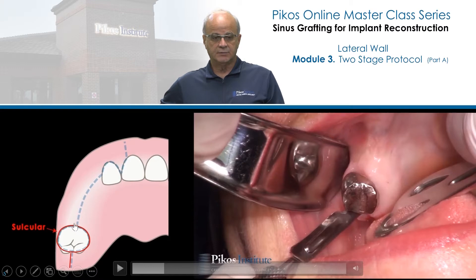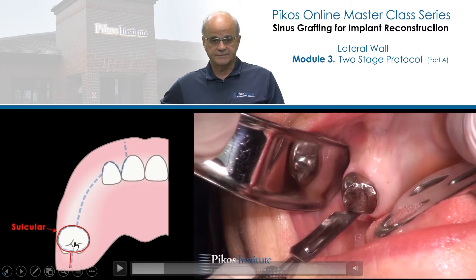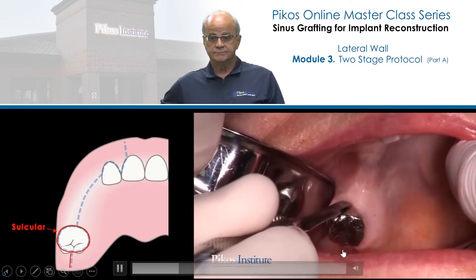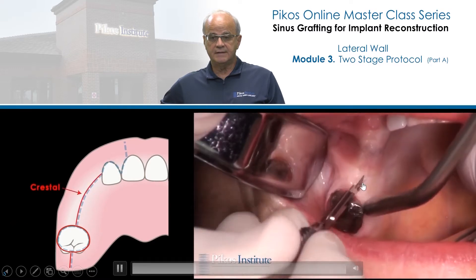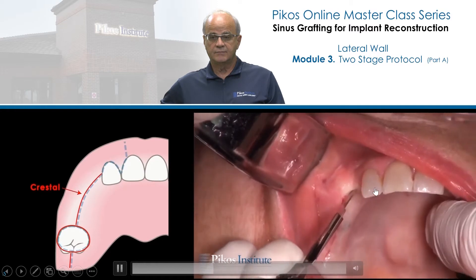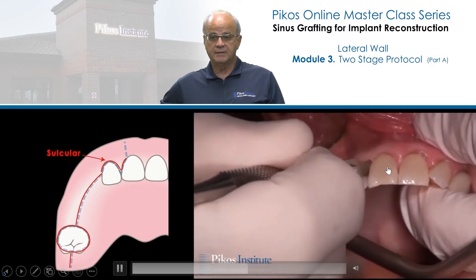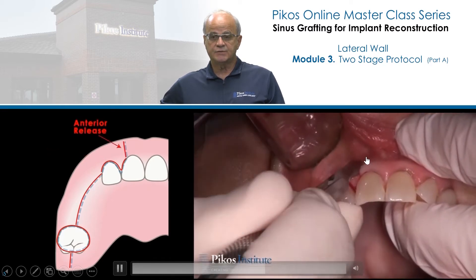I don't like to limit myself to just a release at the base of the molar here and distal to the lateral incisor right here. I don't like that — that's just personal preference. So again, this is the sulcular incision — you see us more or less including this all the way around on the palatal aspect of the molar — and there's our mid-crestal incision, and then sulcular including the papilla.